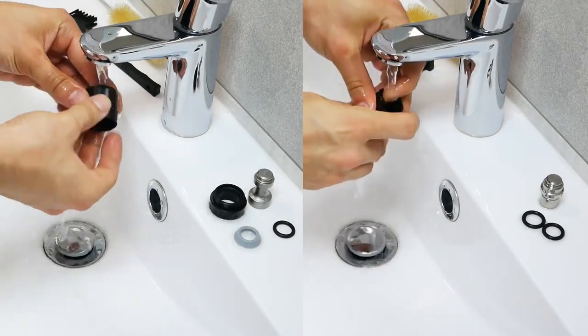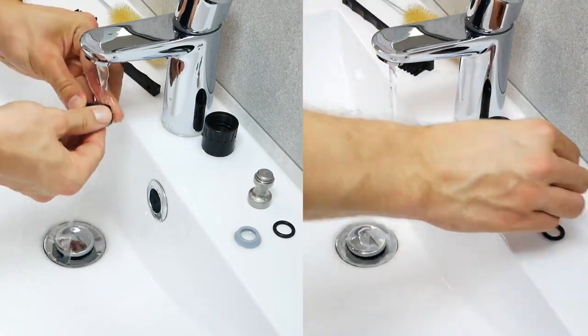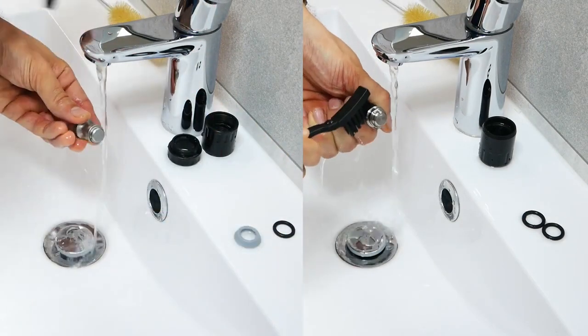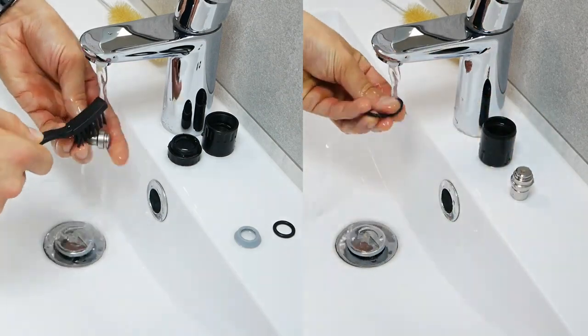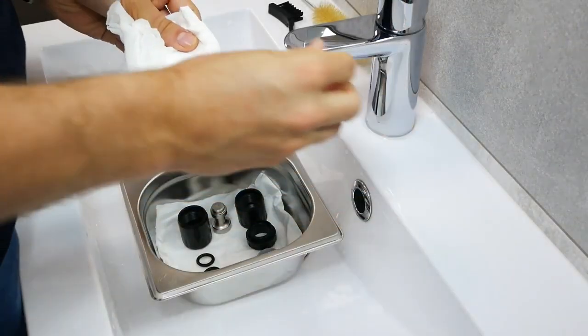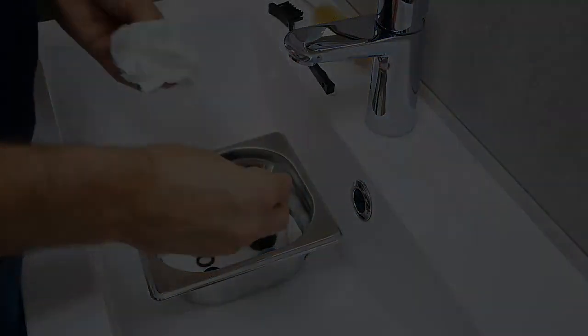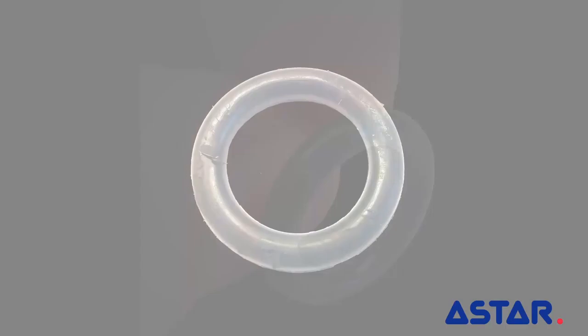Wash the transmitter pin, cap and O-rings or elastomer spring under running water. You can remove dried gel residues with the brush included in the kit. Dry accurately all the elements of the transmitter with a dry cloth or leave them to dry. Check if the O-rings or the elastomer spring are not frayed, hardened or damaged. Replace them if necessary. Spare gaskets are included in the kit.